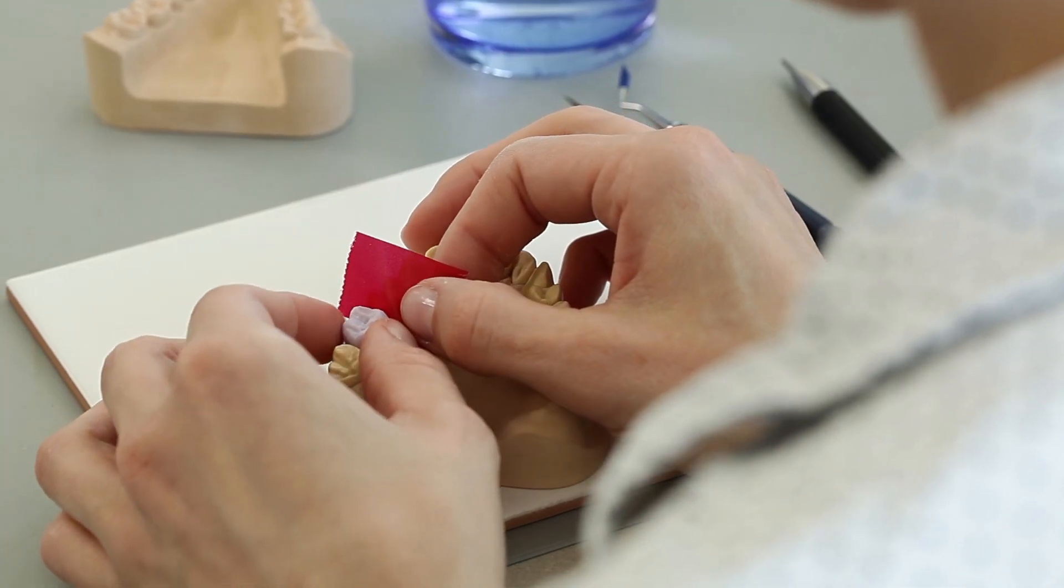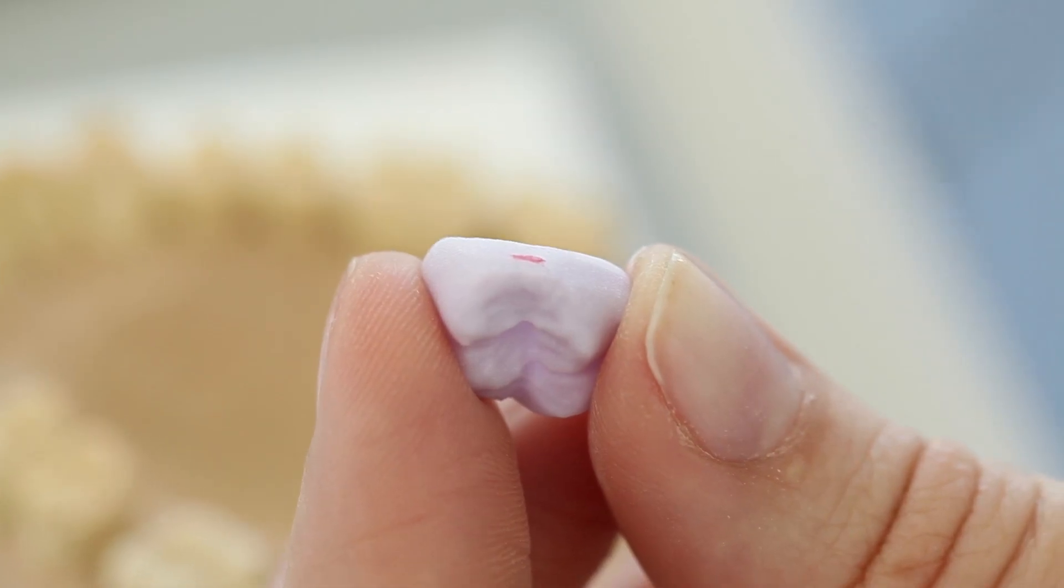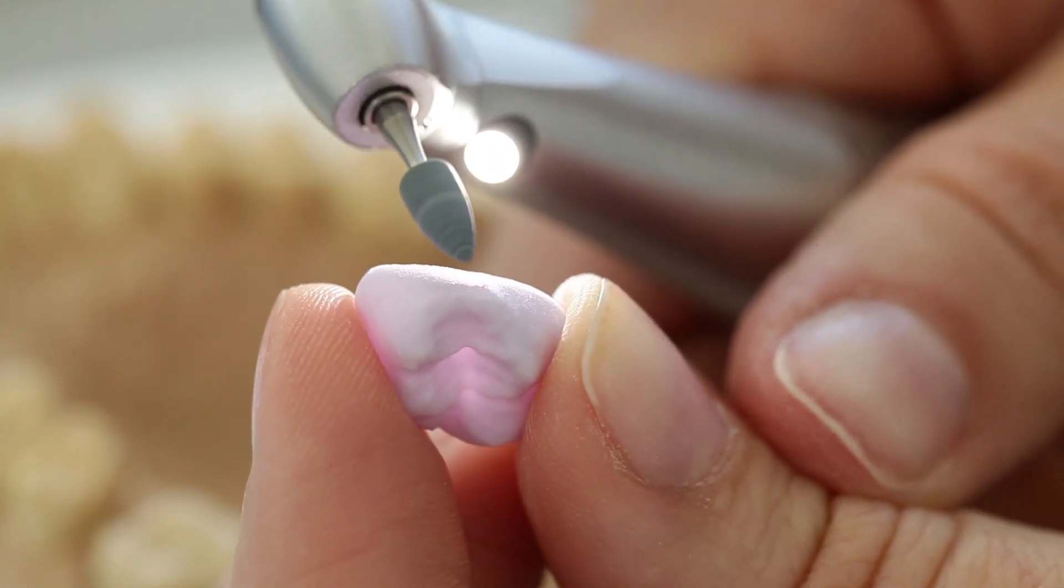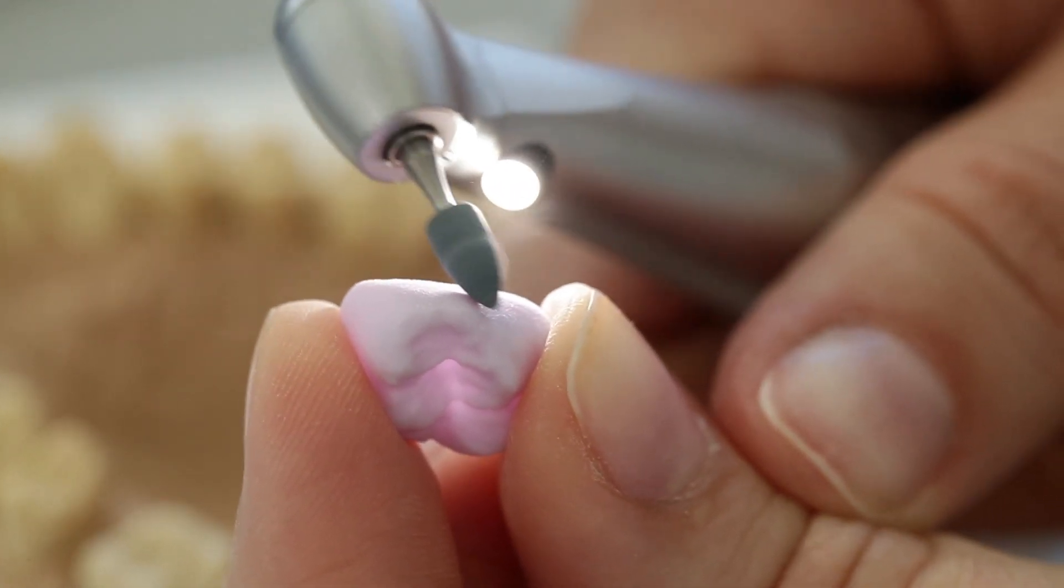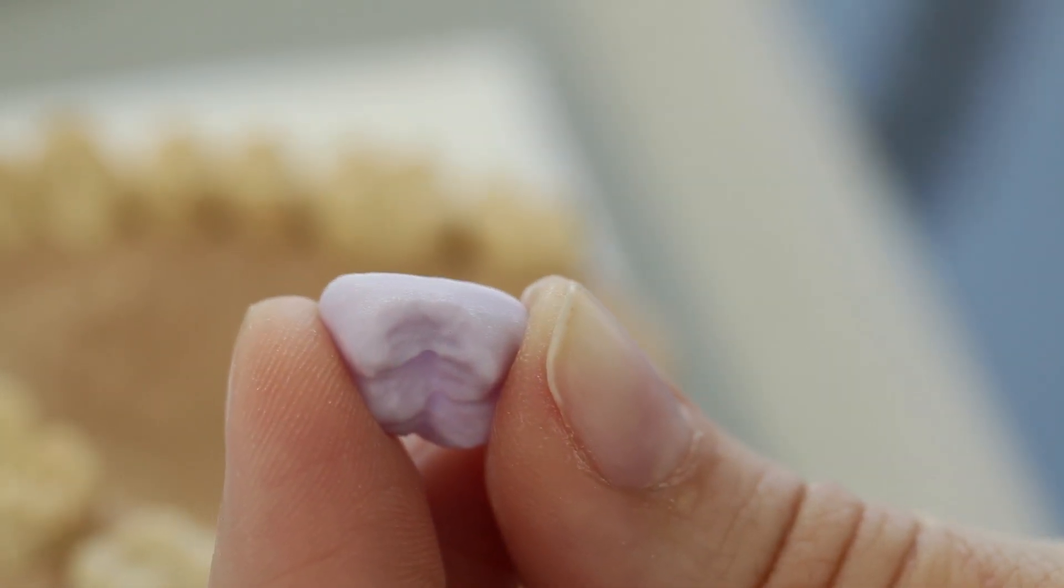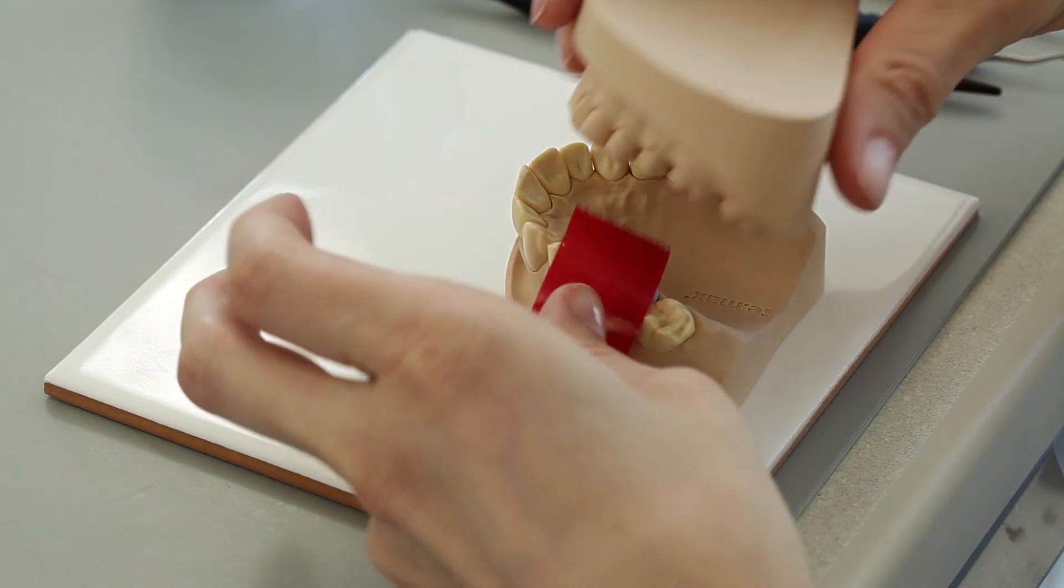Check the proximal contacts with articulating paper. If any adjustments of shape are required, these should be made in the pre-crystallized blue state. The restoration margins should also be adjusted if necessary. Check the occlusion and articulation and make any adjustments if needed.